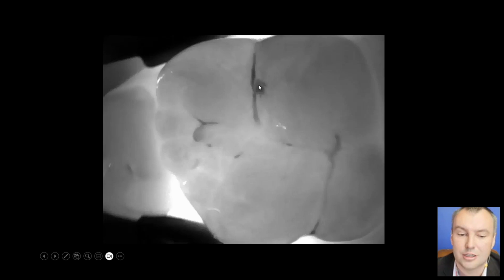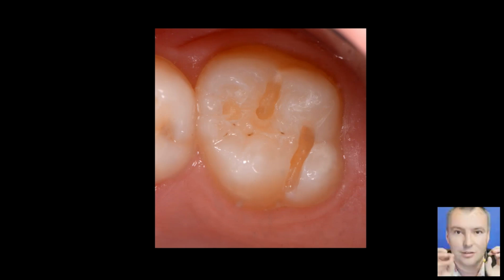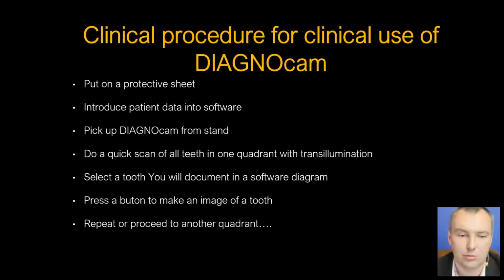These dark spots, almost black spots, are the caries changes that are touching the dentin. As you can see, it can be easily visible. That's why those spots were opened and those were left untouched, because there was no need for intervention. Again, you will start to work minimally invasively and very precisely, knowing where you should work with the drill and where not.